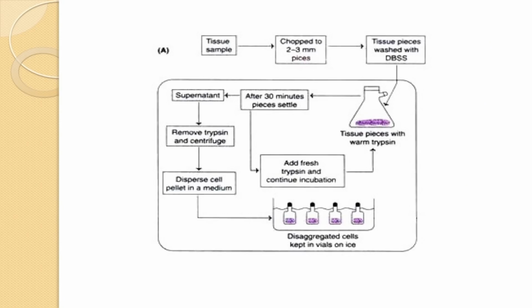So this is called TBVG. What are the functions of these components? Trypsin will be able to cleave the cell attachments, wherever the protein attachment is there, that will be totally cleaved. Next one is EDTA. EDTA will remove any ionic interactions that are present, and the glucose produces an osmotic effect and removes the cell attachment. For that reason we are adding this trypsin, versene, glucose, or TBVG.